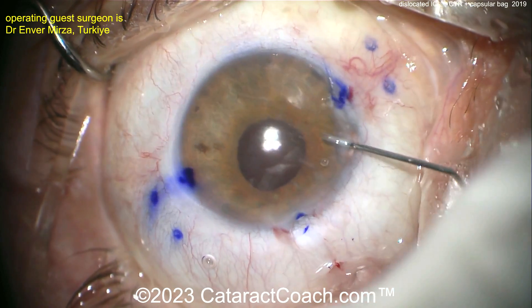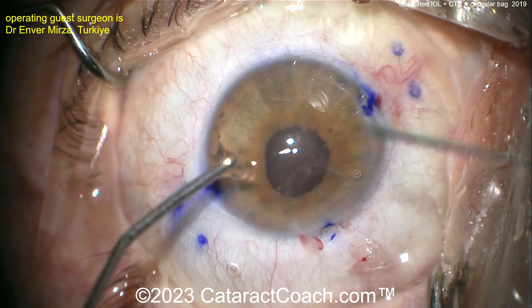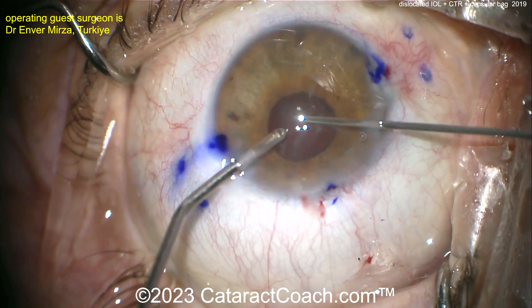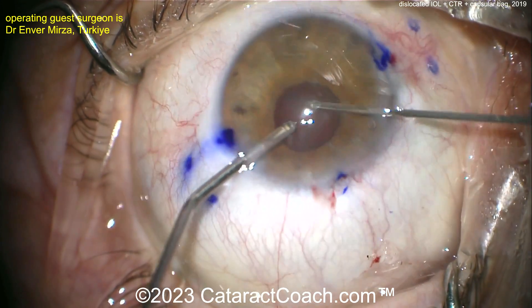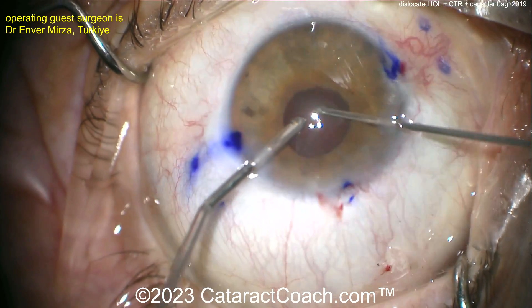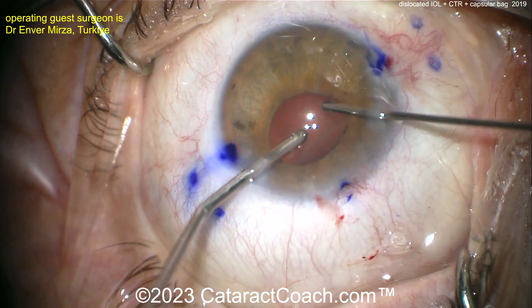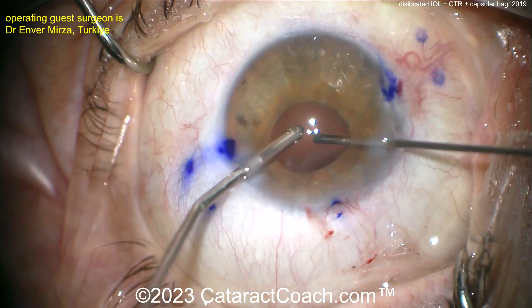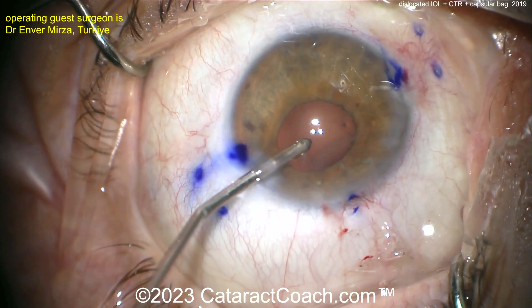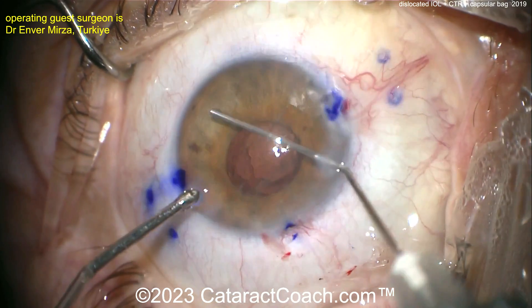Everything looks good. Since the anterior vitrector is already out, put in some more triamcinolone and take your time doing a nice clean anterior vitrectomy. Remember, with the Yamane/Imani technique you can get entanglement of vitreous with the IOL, so to avoid that, make sure you do a thorough clean anterior vitrectomy. The video is obviously edited and sped up, but it looks great — much better.